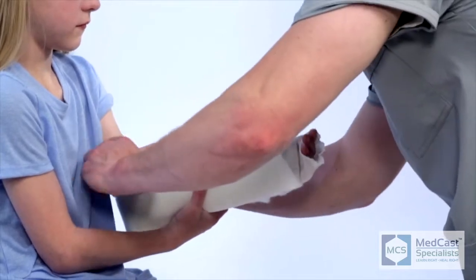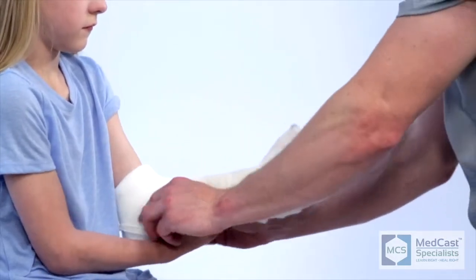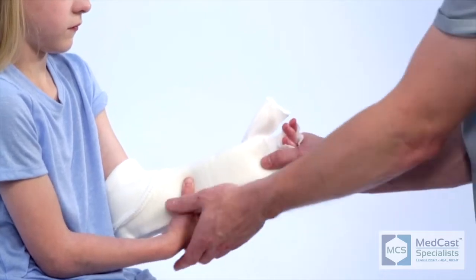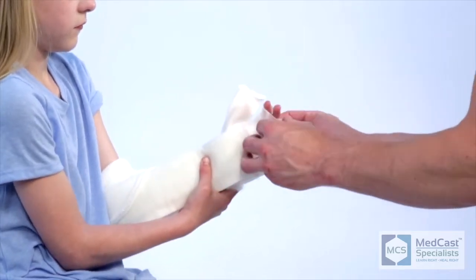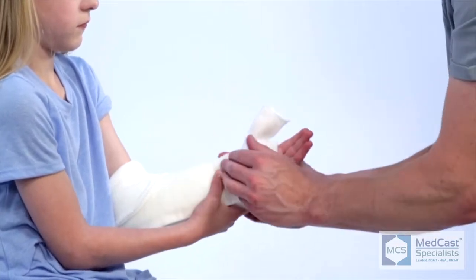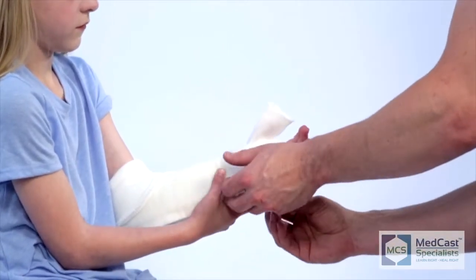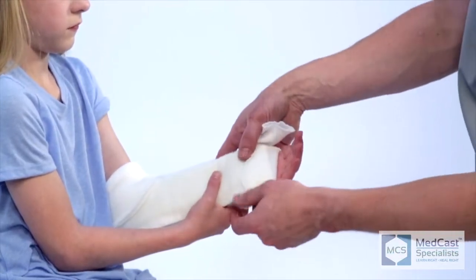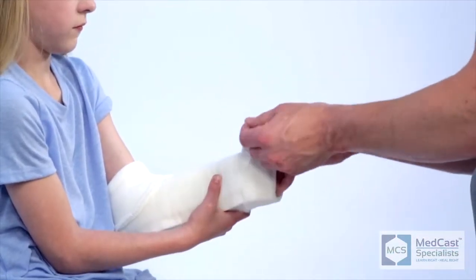As you see, we use the stockinette to help hold the splint in place — it makes application a lot easier. You can also use the patient to help hold it, as we are here. Oftentimes a patient, especially a pediatric patient, will come with their mother. It's always good to put their mom to work and have them hold the fingertips or the back of the humerus to help stabilize the patient.